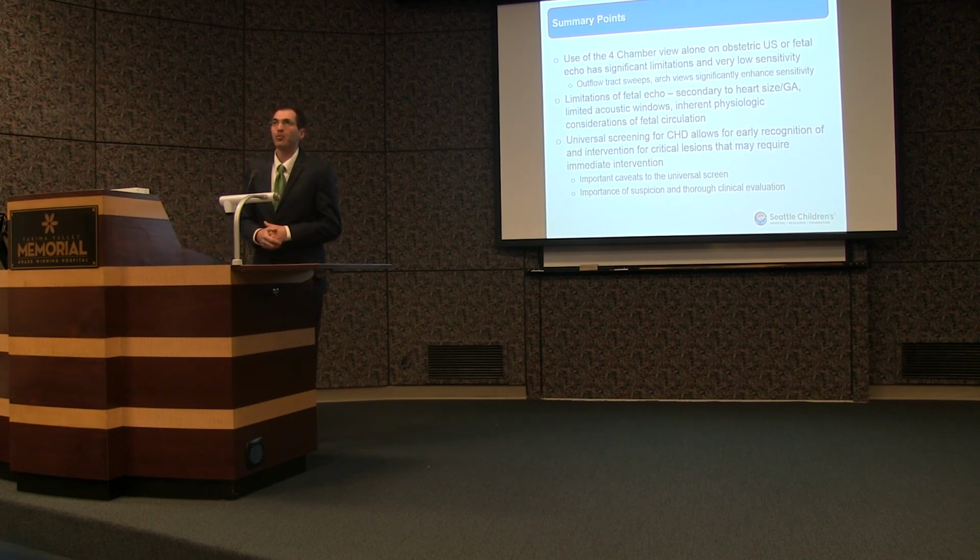And then that just brings me to some summary points. So the use of the 4-chamber view alone on obstetric ultrasound or fetal echo has very significant limitations and very low sensitivity. So once we incorporate the outflow tracts and the aortic arch or the arch views, both ductal and aortic, that can significantly enhance your sensitivity and really help us pick up those critical lesions. There are also limitations of fetal echo that we talked about. It could be secondary to just the gestational age and the heart size, limited acoustic windows, maternal factors, or the physiologic considerations that we've talked about before.